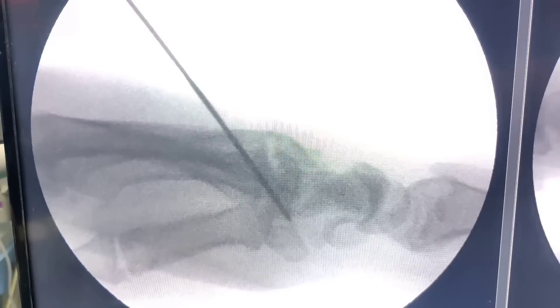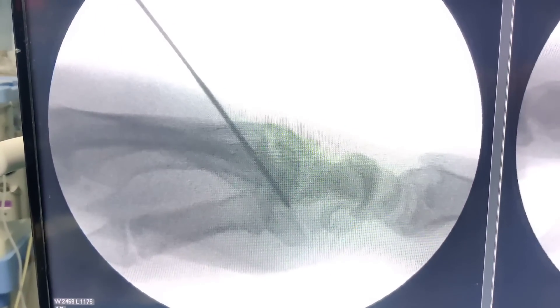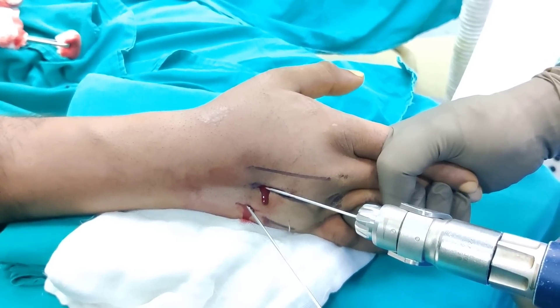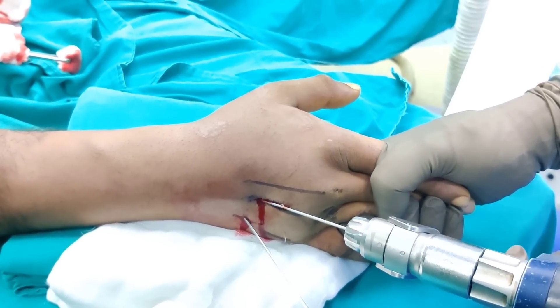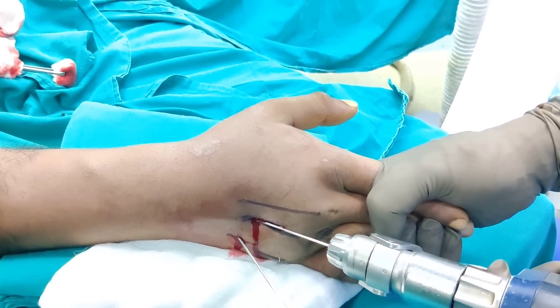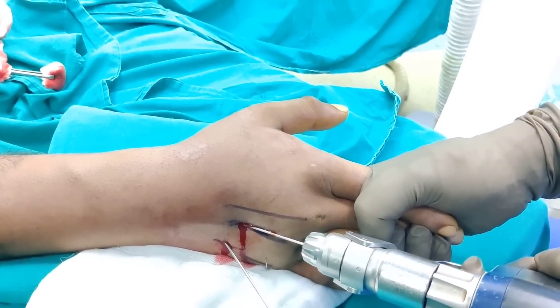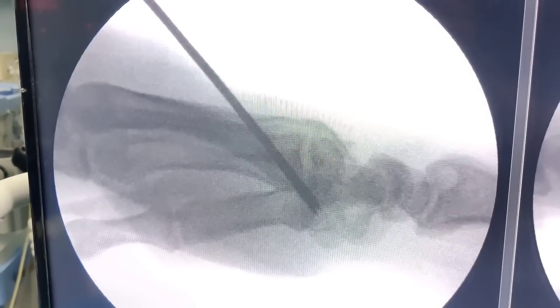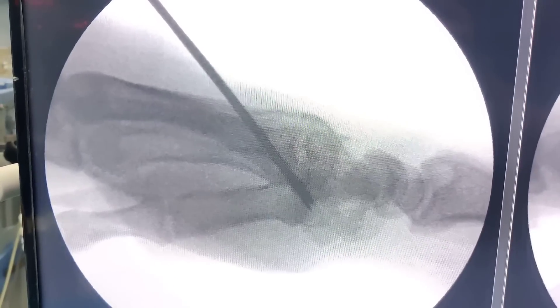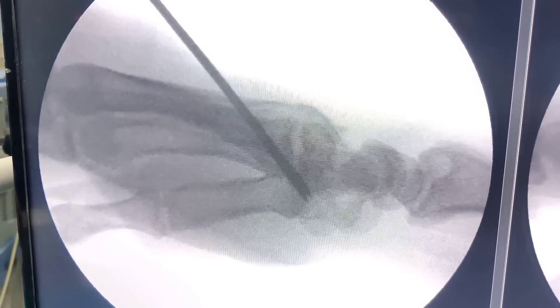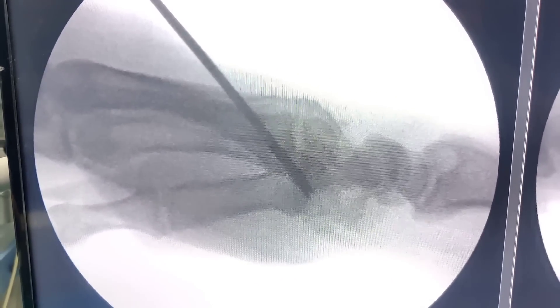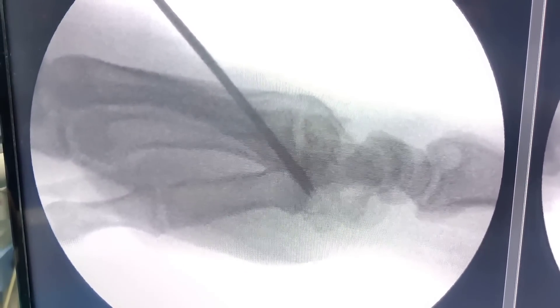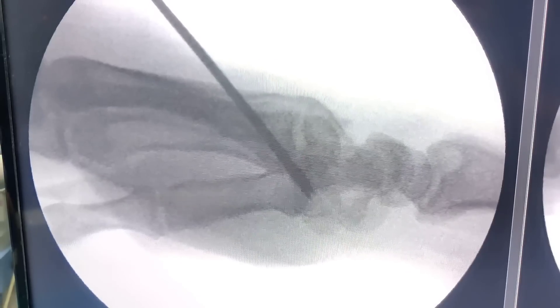Applying the same principle, I am now going to pass my second K-wire for the ring metacarpal. I have made a stab hole, taken an artery clip, separated everything, and after checking the wire position on the lateral I am passing it and will confirm on the C-arm. After passing the second wire following the same principles, the reduction is absolutely anatomical — and even after releasing traction the view on the left shows no traction applied and everything looks pretty good. Let me now reassess the middle metacarpal to see if I need to pass another wire.